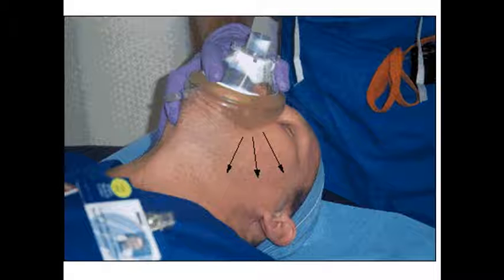So quickly go to two-handed ventilation, re-establish an effective pneumatic seal, and then return to mask ventilation with your right hand. This, of course, is easier said than done and requires much practice. However, you will get there in the end.